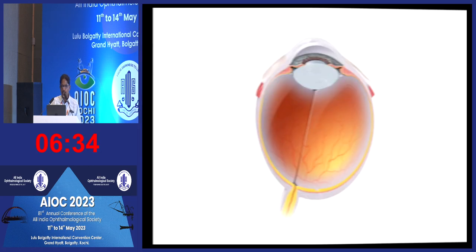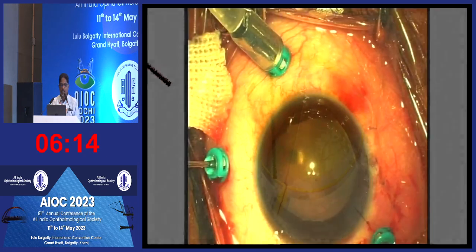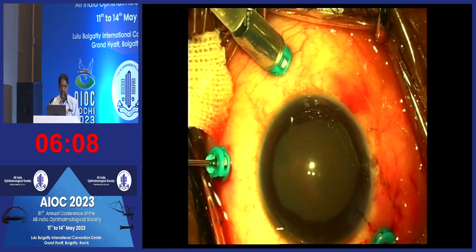The ultrasound showed some small high intensity echoes, but it was not very clear what sort of foreign body it was. From the history we were not sure what went inside, and we could not identify the exact length of the stick from the ultrasound. This is how the foreign body is located. Where the superficial scar was sutured, the long piece of foreign body is sticking from the limbus where the injury had happened, and it was hitting the retina just nasal to the disc.